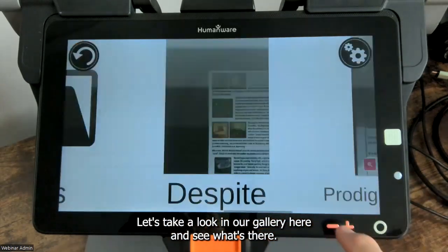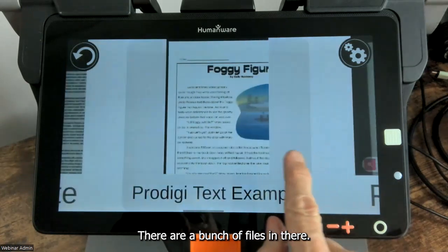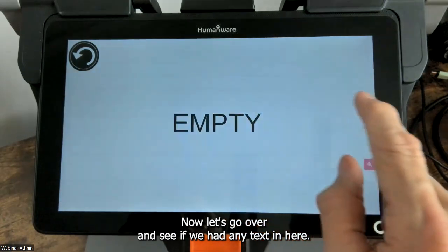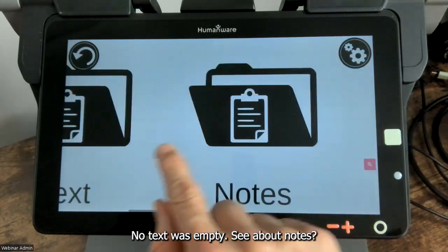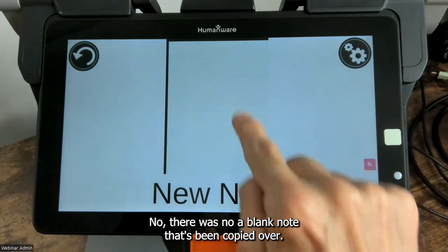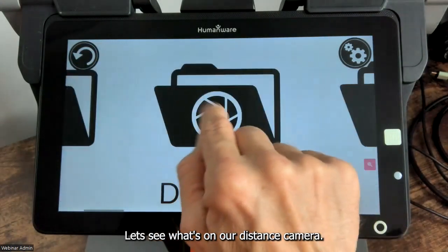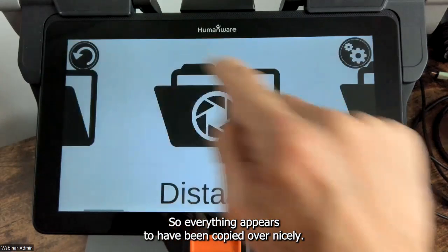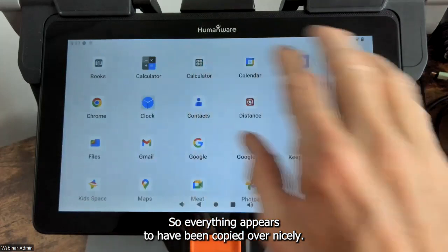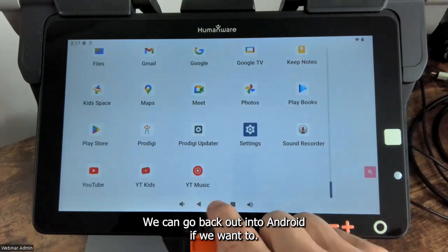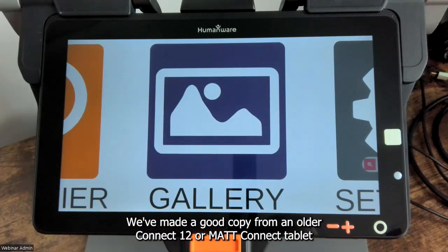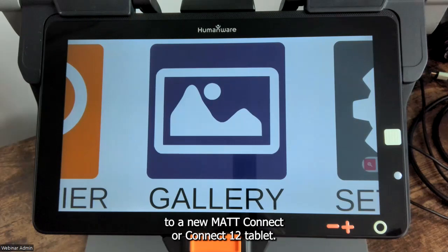Let's take a look in our gallery and see what's there — there are a bunch of files in there. Let's see if we had any text — text was empty. Let's check notes — there was no note copied over. Let's see what's on our distance camera — there's a picture of my puppy, Wiley. So everything appears to have been copied over nicely. We've made a good copy from an older Connect 12 or MatConnect tablet to a new MatConnect or Connect 12 tablet.